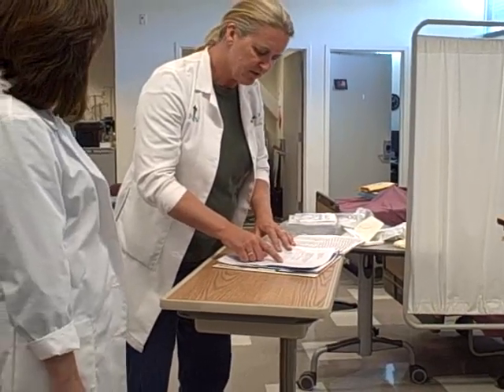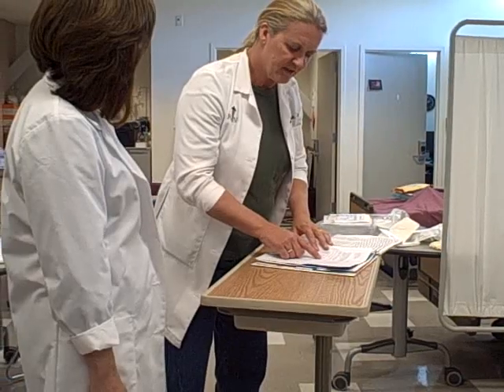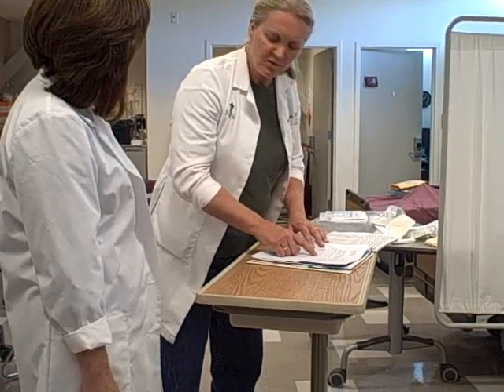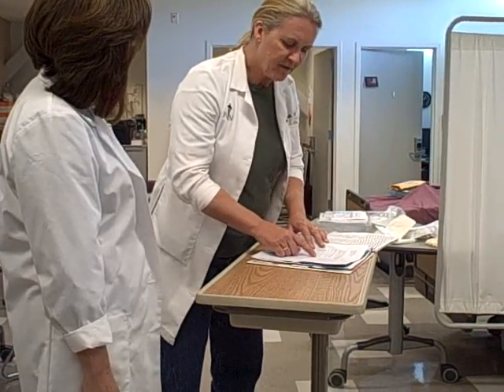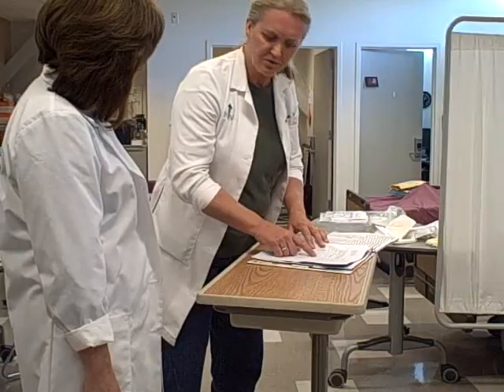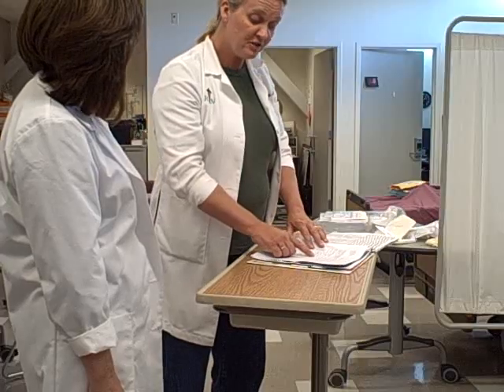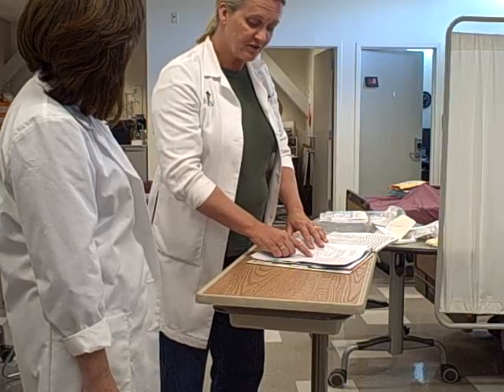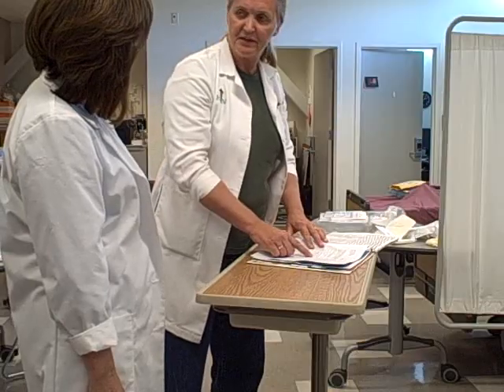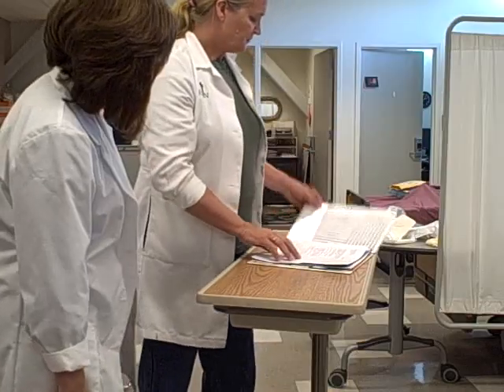She's a post-op this morning and has not voided yet. Other than that, she's doing well — she's not in pain, vital signs are stable, she's alert, oriented, and appropriate. No allergies to latex or betadine, though she does have an allergy to penicillin. Okay, good job Mary. Let's proceed.